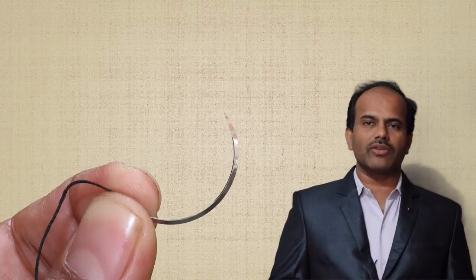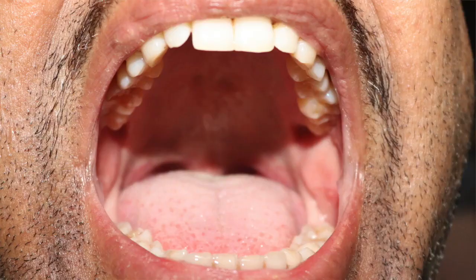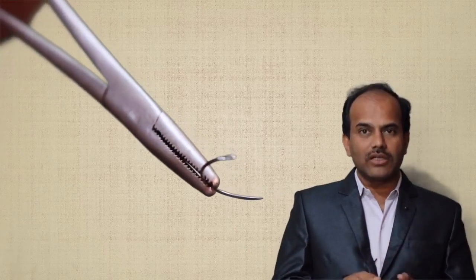The curved needle is used where very little space is available, for example when operating intraorally, in the anal region, or in cavities like the abdominal cavity, where we have very little space to turn the instruments and handle the suture material. In those conditions the curved needle is helpful.